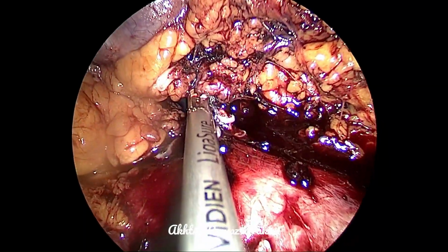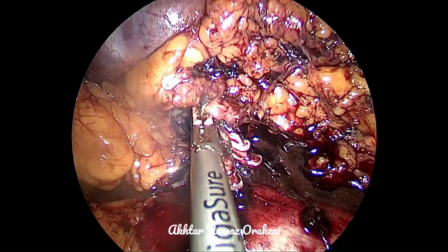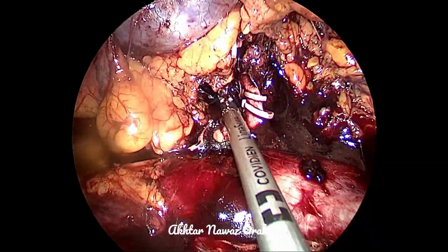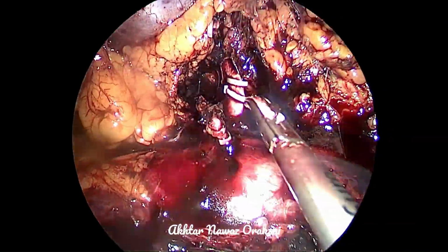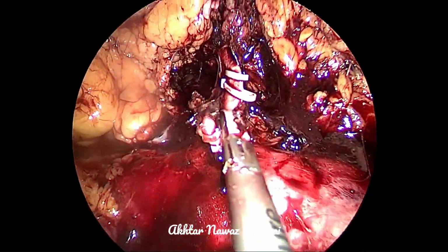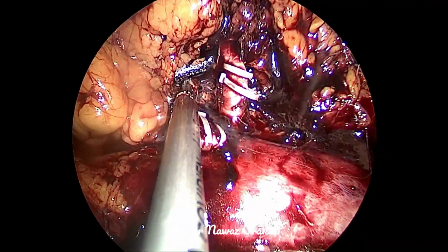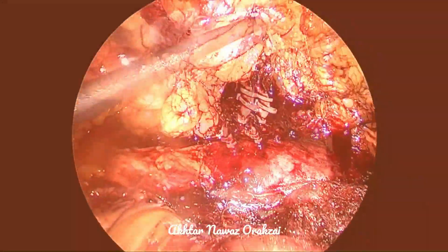So the vein is now complete and we have divided it. The side towards the major vessel is secure. And now we are further applying another clip on the artery, as this is a big artery and it's better to place another clip while we have the chance.